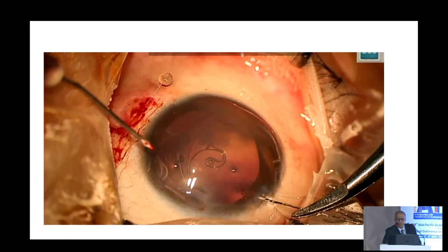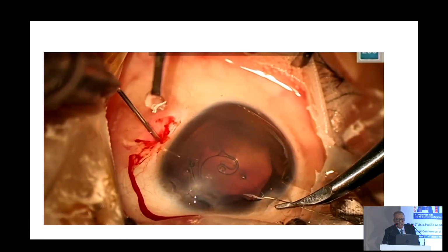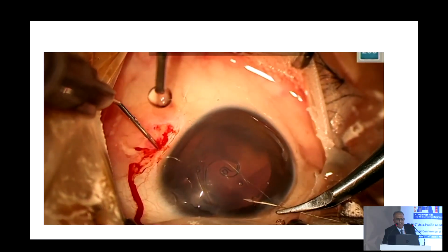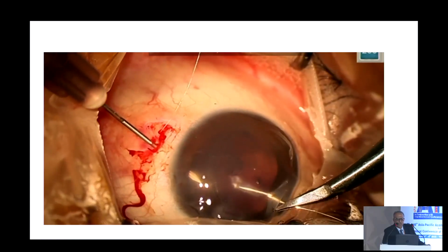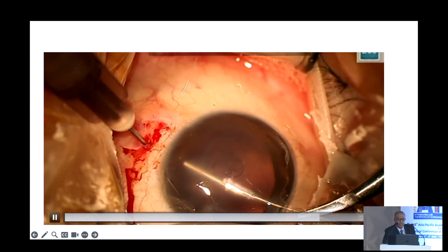Dr. Chi, you were about to lift the, yeah, okay. So I just do it and then I take it in, I railroad it in, then move it. This is unedited because I want you to see how, with both your hands, you're able to do it, and see how closely I am holding.